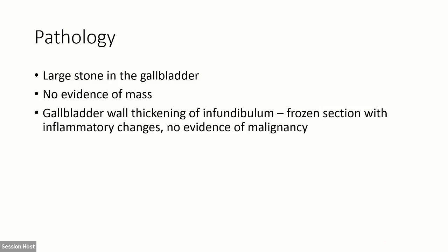And I recognize now that these are all essentially benign cases, but a couple of different applications of how I really think that using ultrasound can be super useful in each of these different scenarios. So I always have my fellows do a laparoscopic ultrasound of every normal gallbladder. And I'll be honest with you, I think that that's a super useful way of being able to laparoscopically get familiar with the porta hepatis, finding where the structures are. And it's just that repetition that lets you be more comfortable with what you're doing so that you can apply it, particularly when you have situations in which things are not normal.